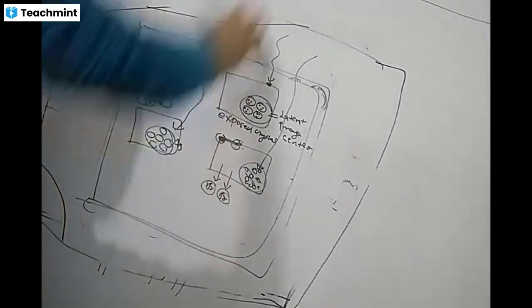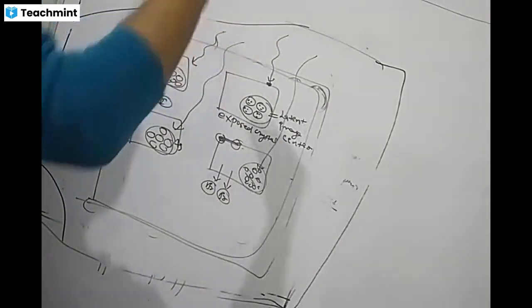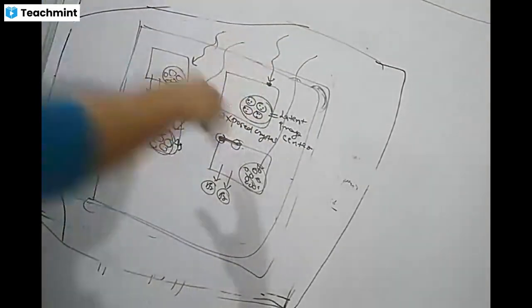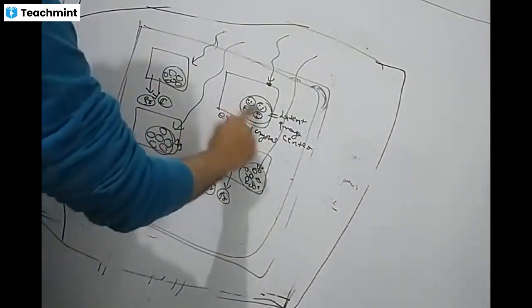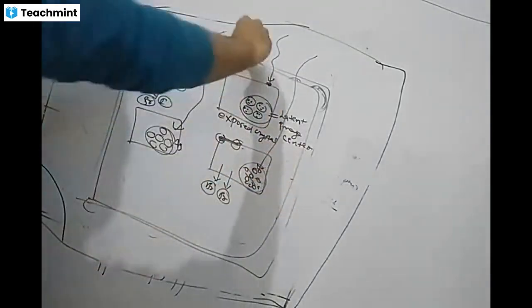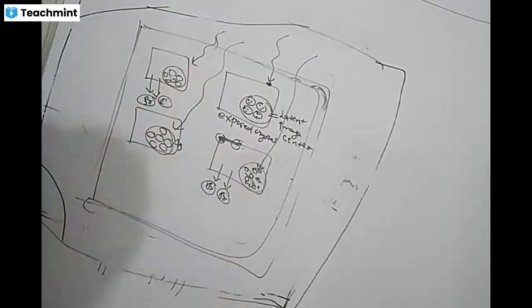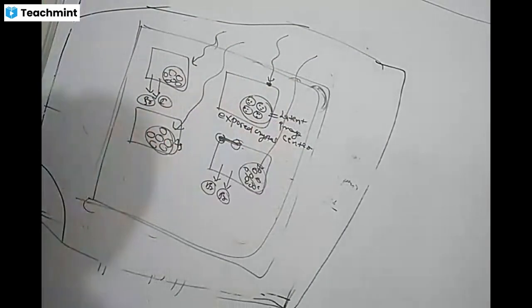So in this emulsion, when the photons coming out of the patient, whether light photons or X-ray photons, interact with the emulsion, they interact with each crystal. Inside the crystals, as an example of Frenkel defect, they have positive charges inside and negative charges on the surface. The negative charges lose electrons, and those electrons combine with the Ag plus, and they are reduced and collect at one center. So these small pieces are called latent image centers.